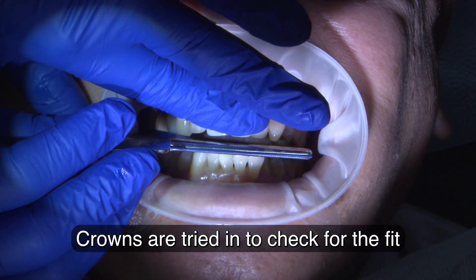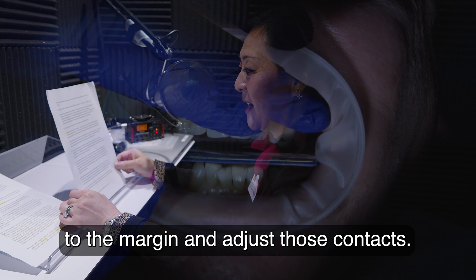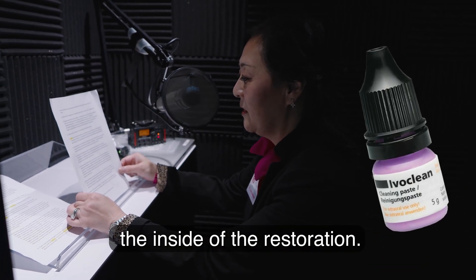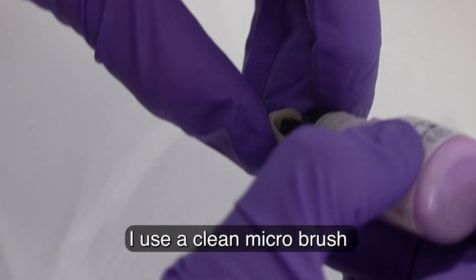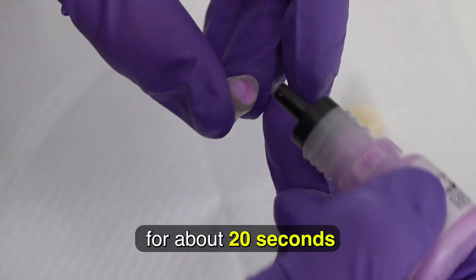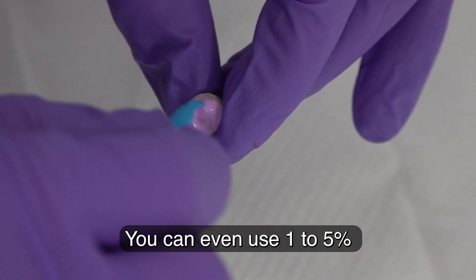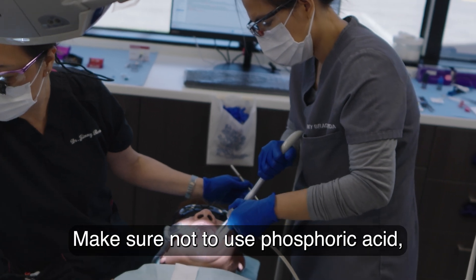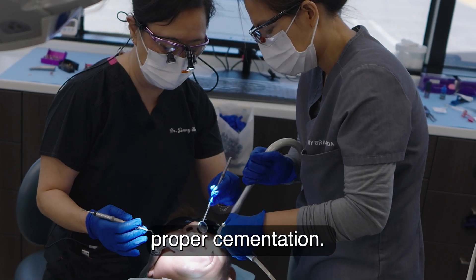Crowns are tried in to check for fit to the margin and to adjust contacts. IvoClean is used to clean the inside of the restoration to decontaminate. Use a clean microbrush and scrub the intaglio for about 20 seconds, then rinse and dry. You can also use one to five percent sodium hypochlorite as a cleaning agent. Make sure not to use phosphoric acid, which will interfere with proper cementation.